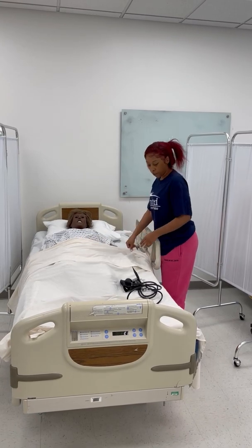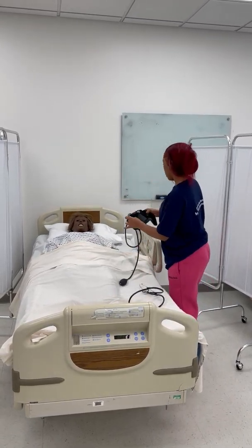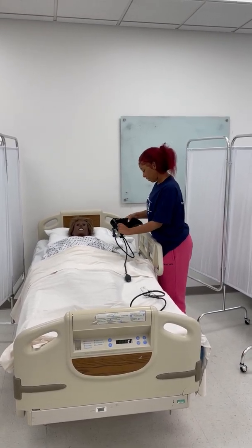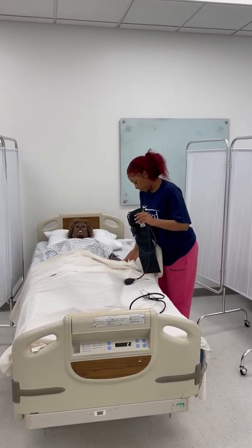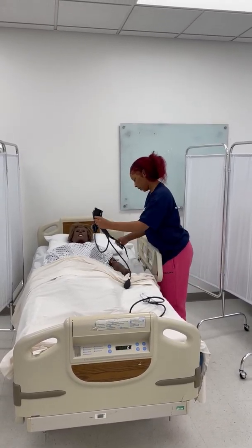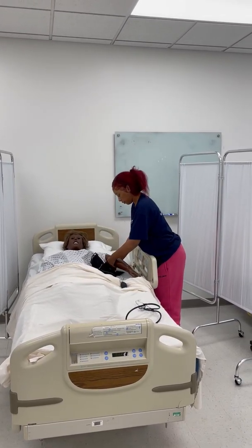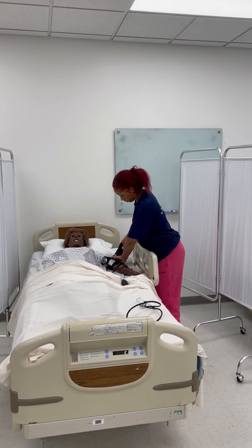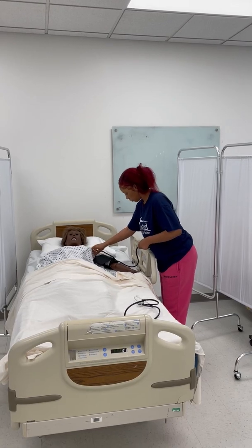Okay, great. First, I'm going to start with a two-step blood pressure. During the two-step blood pressure, Morgan is going to place the blood pressure cuff on the patient's arm. Once she gets that into position, she will check a radial pulse as she is pumping up the blood pressure cuff.